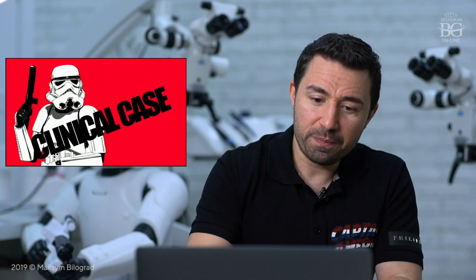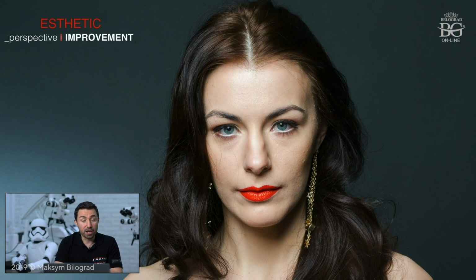Okay, so let's go. A new clinical case, the clinical case that we call hybrid restorations. Actually, you will see how we can combine, within one clinical situation, different types of materials like ceramic and composite together.